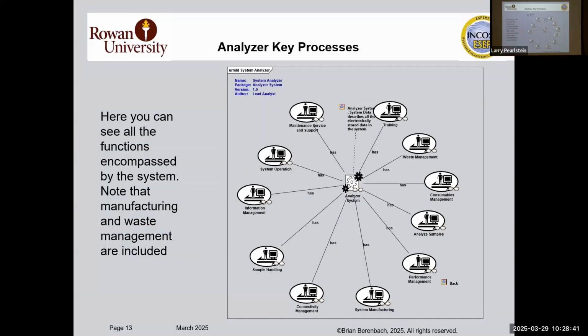And you'll notice that the eyeglasses down there mean that there are diagrams underneath this. You just double click and you get to a low level diagram. And it goes way down, because obviously different people are going to be getting different pieces of this to work on, but they will have to fit together.